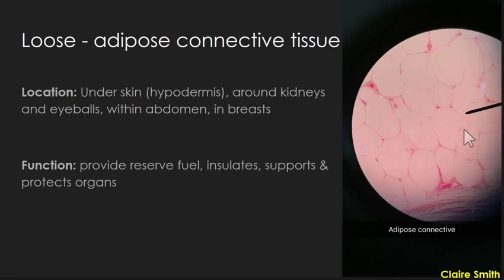Cellulose is in plants. Cellulite, is that what they call it? Anyway, you see those like bumps on your legs or places that have more fat. It's because these cells are so big, right? So you can literally see those adipose cells under your skin.